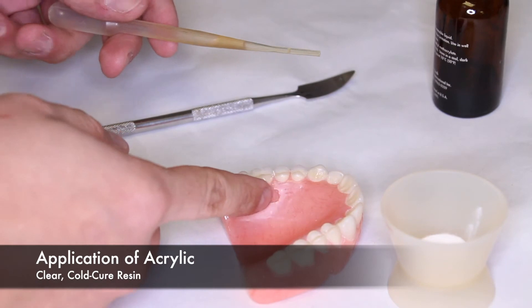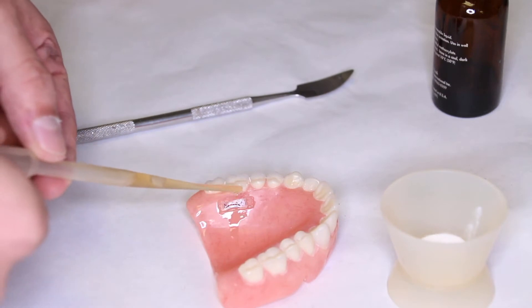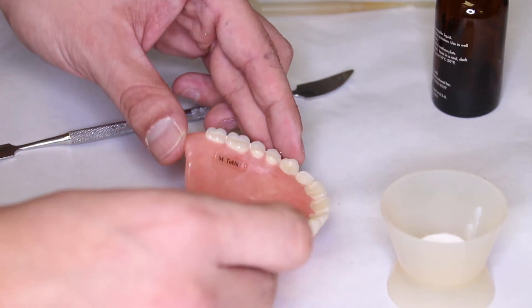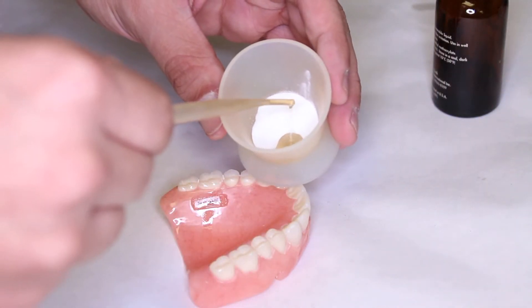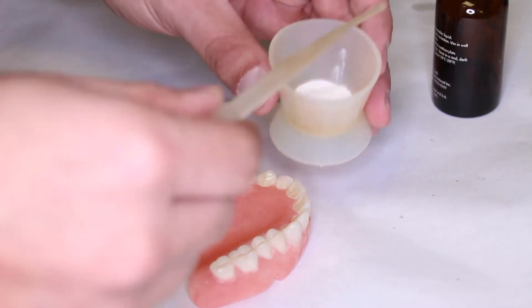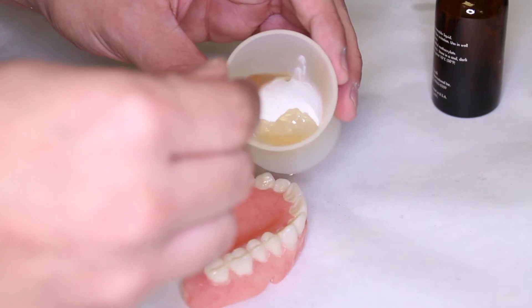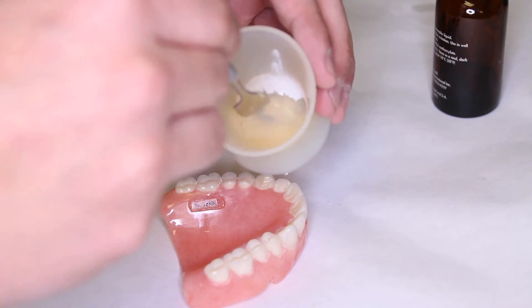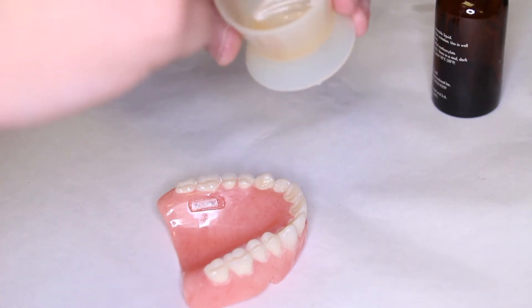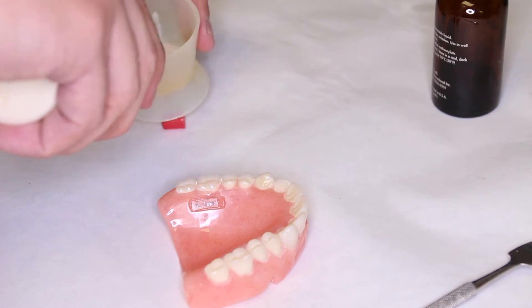To proceed to the following step, you will need clear cold-cure or self-cure resin, usually referred to as orthodontic resin. The first step is to wet the area receiving the acrylic with monomer. This will aid in the bonding of the new acrylic to the pre-existing acrylic. Next, take your polymer and monomer and create a mixture. If the consistency is too liquidy, it will run everywhere. If it's too thick, it won't flow into the recess you've created. The proper mixture is paramount in making sure that the tag stays in place.